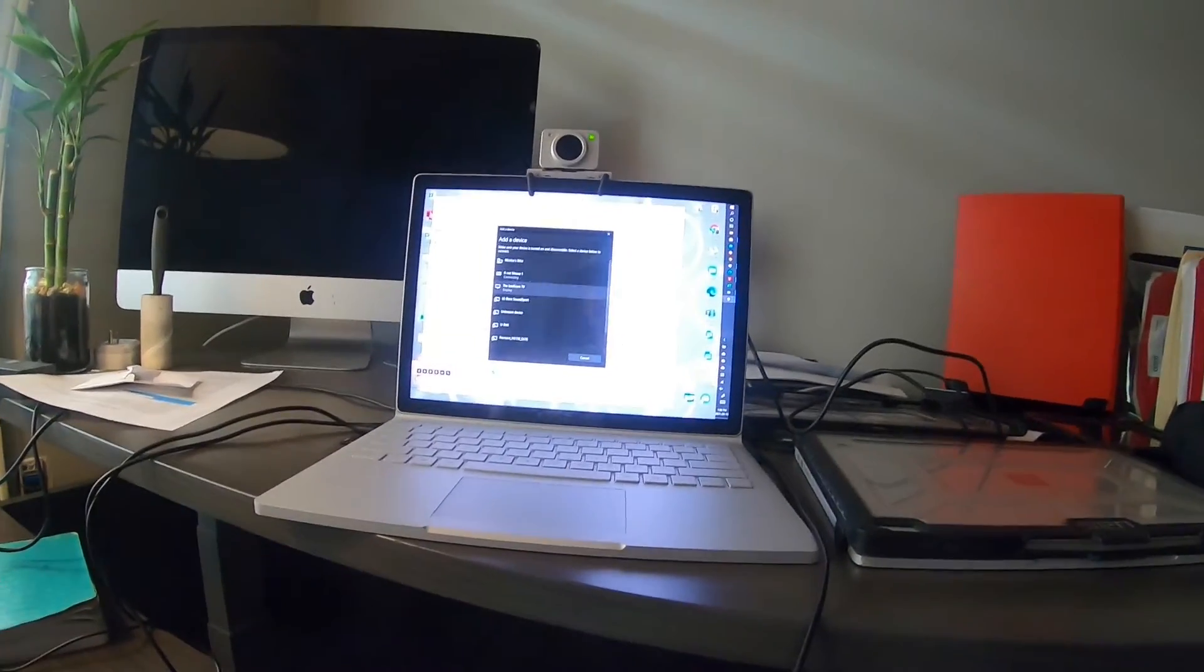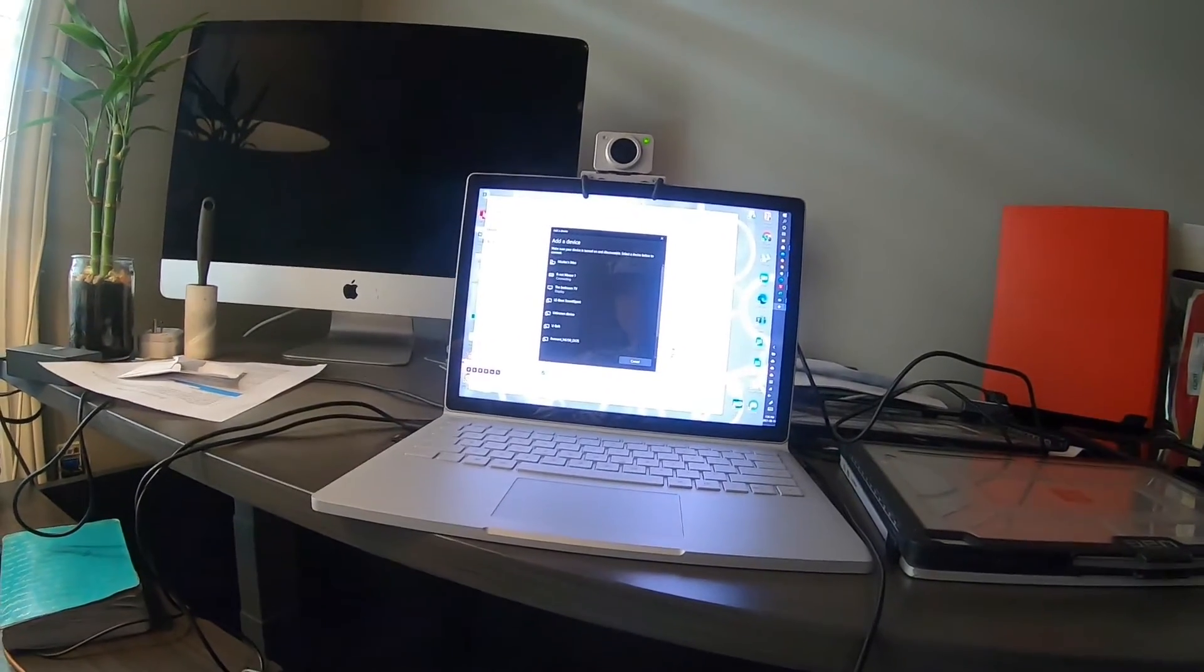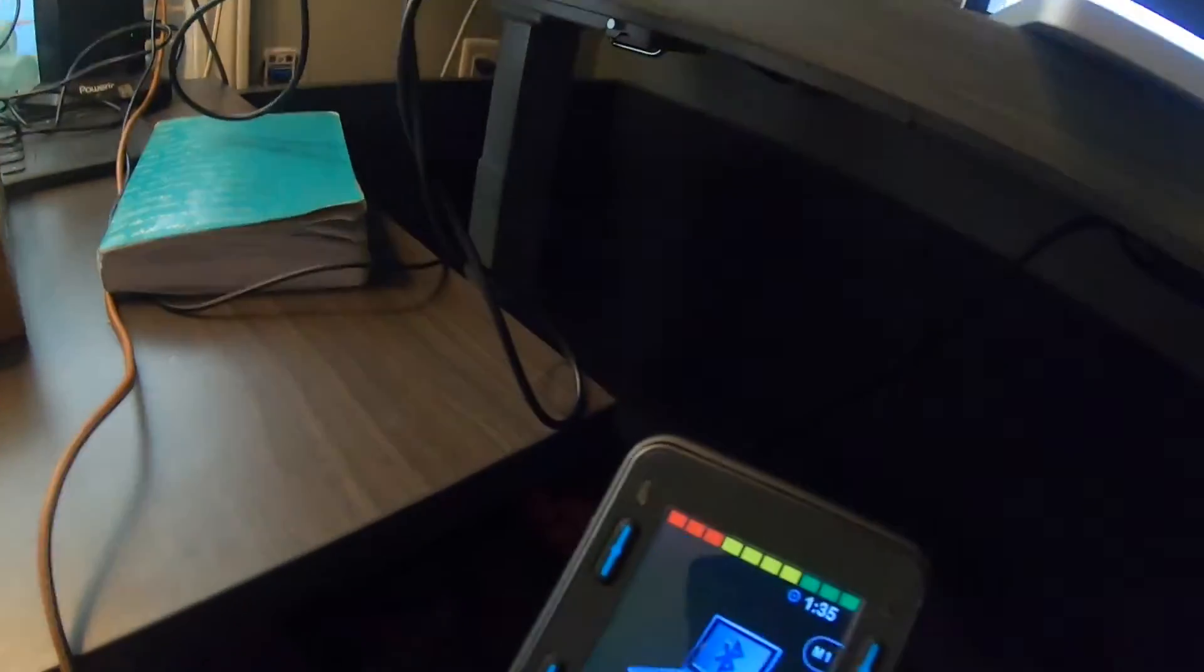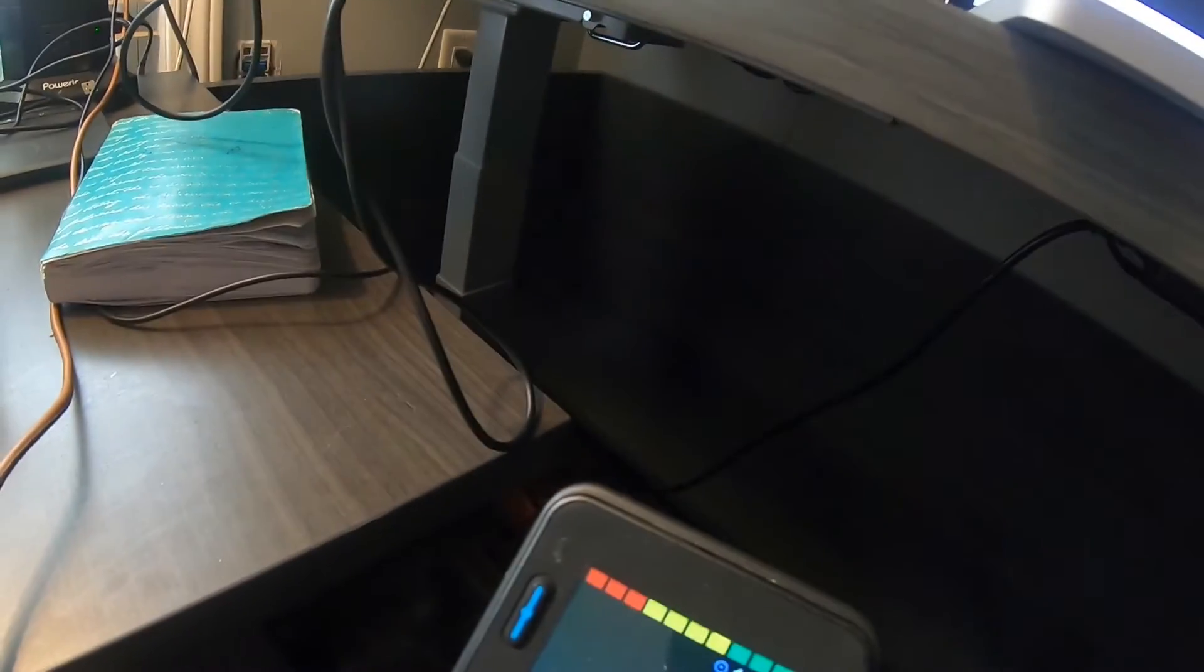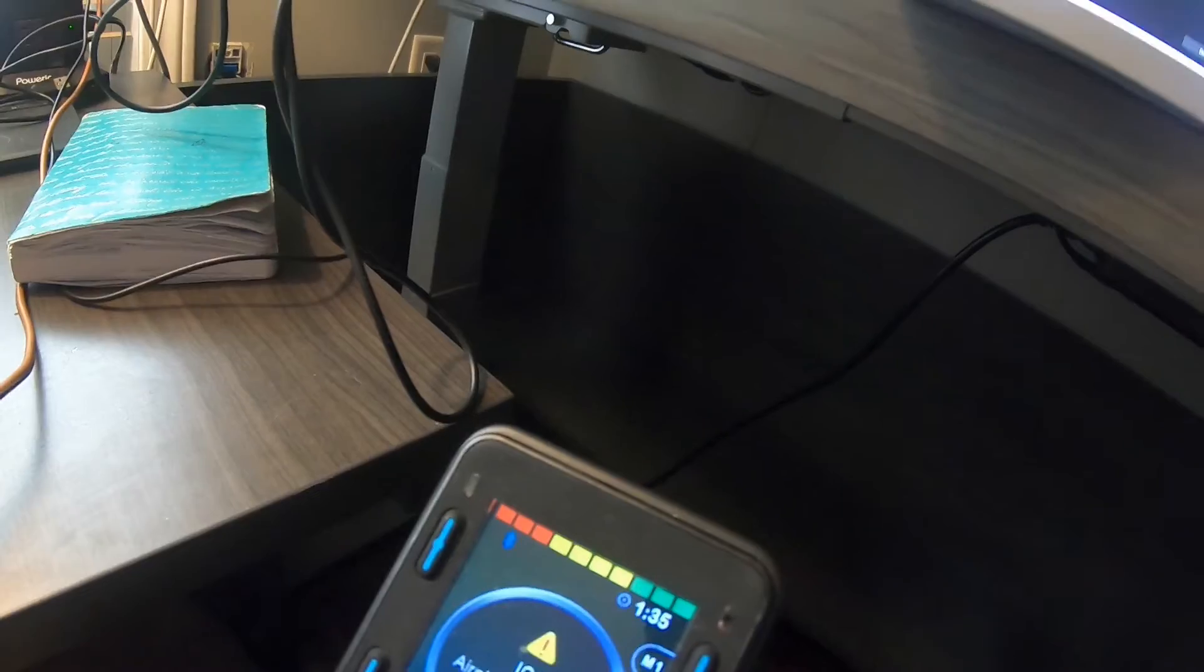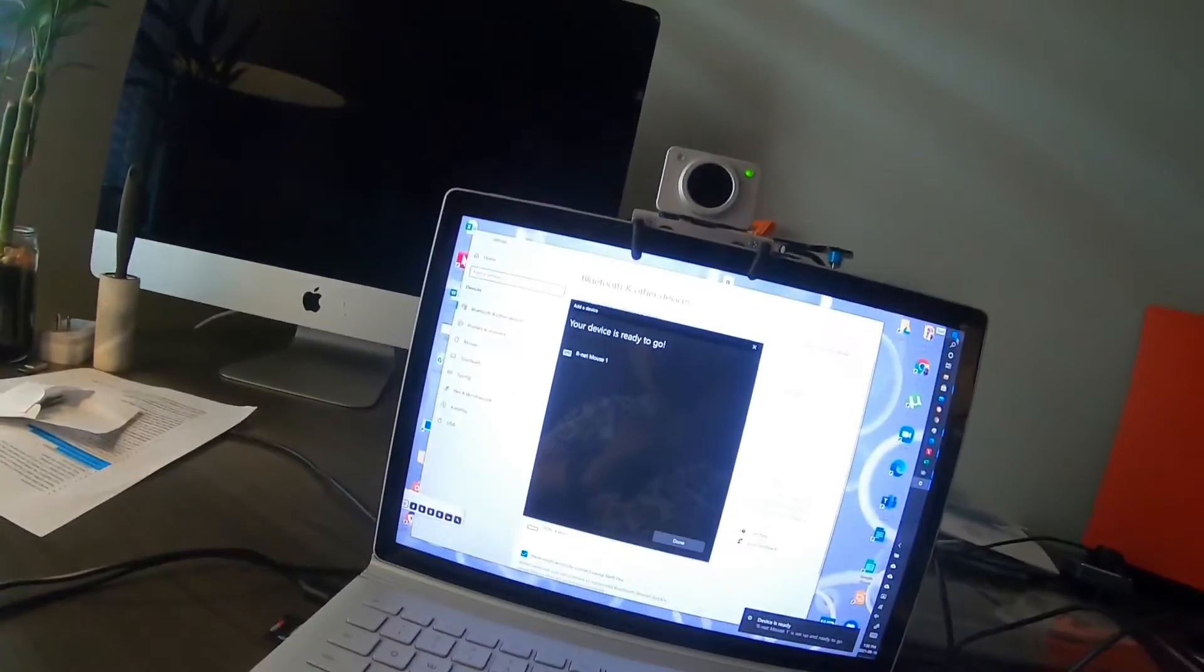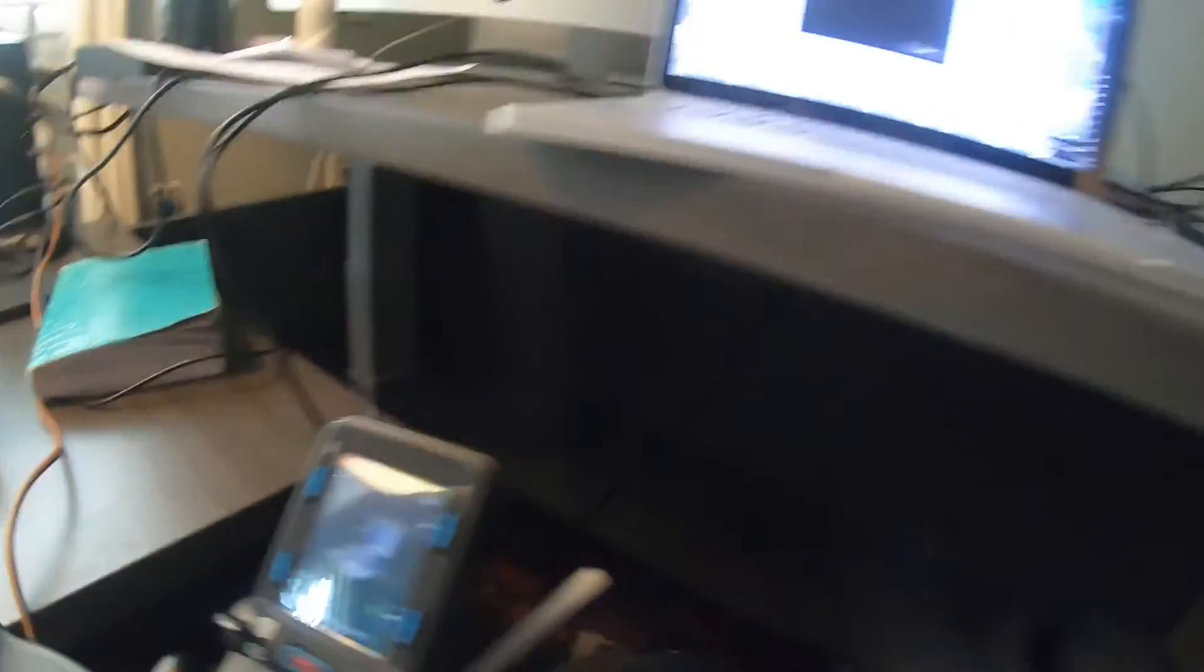And then it connecting, connecting, and then you'll see there's like a flashing Bluetooth up there. And it's flashing when it's not connected. And then it will, once it's solid, that means it's connected. Device is ready to go. Bam.